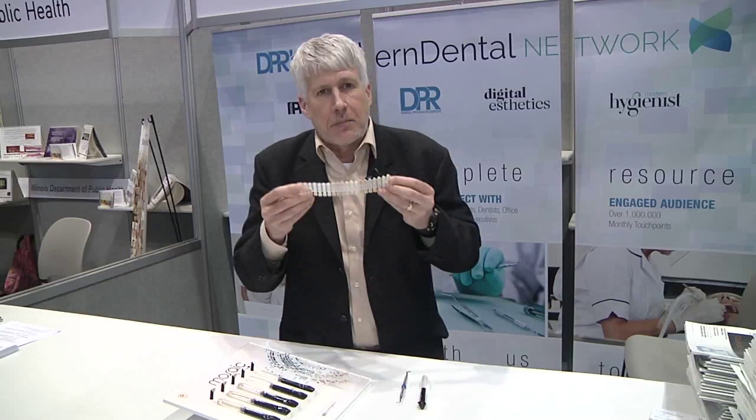And so as you can see, you can't drop these — they don't get bent or scuffed or scarred. This is a big thing that I like: being able to match shades by putting it up to the patient, being able to curve it around the curvature of the face, and being able to match these well, and then layer if you need to.